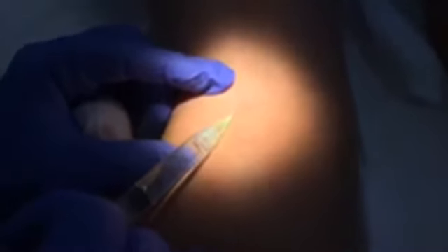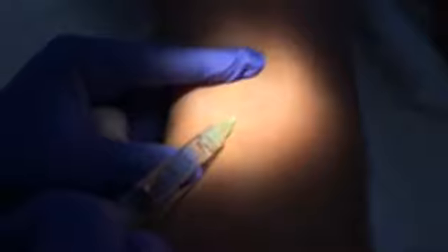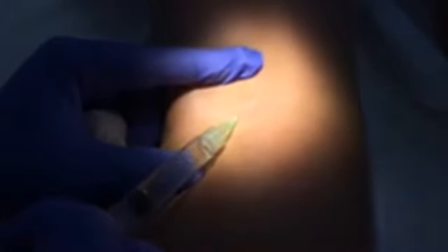Okay, so we're going to go into this reticular vein. Now, some people will actually do this, where they'll pull back a little bit and see if there's blood in there. See, there's a little bit of blood in the tip there. So that's a good thing. So we're injecting now into that vein. You can see it spreading into the vein.